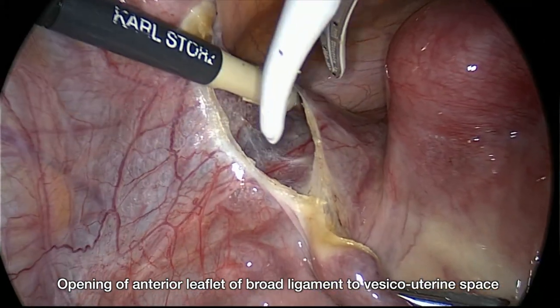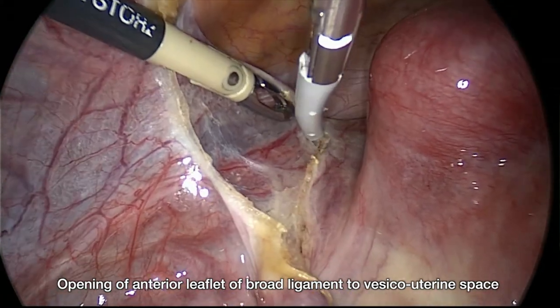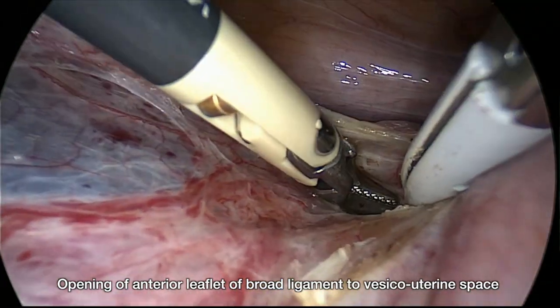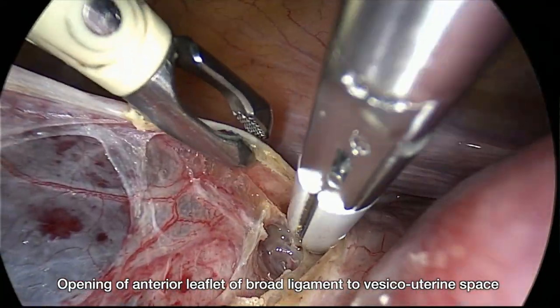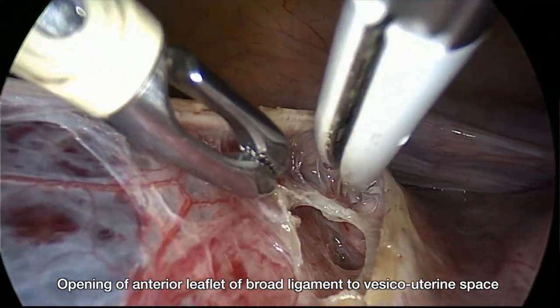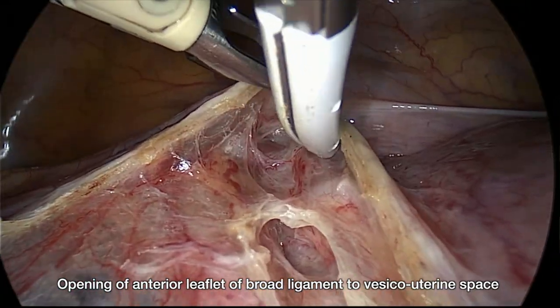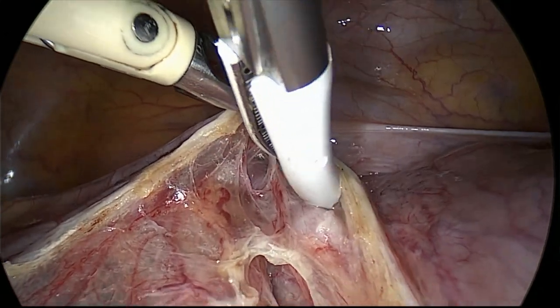After we moved to the opening of the anterior leaflet of the broad ligament up to the vesico-uterine space. You can observe the dissection ability of this Maryland instrument. The vessels are quite well skeletonized, and the peritoneum is separated towards the vesico-uterine fold.